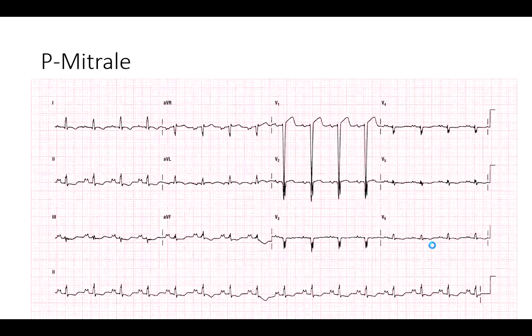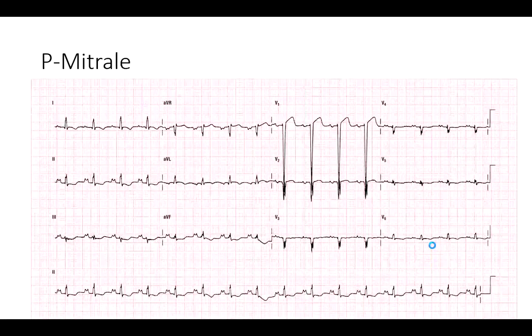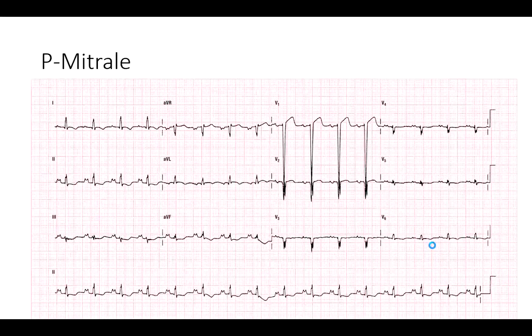And I go, that maybe is what's going on. Folks, I may have never met this patient, and I may look at this and go, does this patient have hypertension? Does this patient come in with a headache? Does this patient have some issues with... I haven't even seen this patient, and I'm looking at this and I'm starting to get a clinical picture of who this person is.